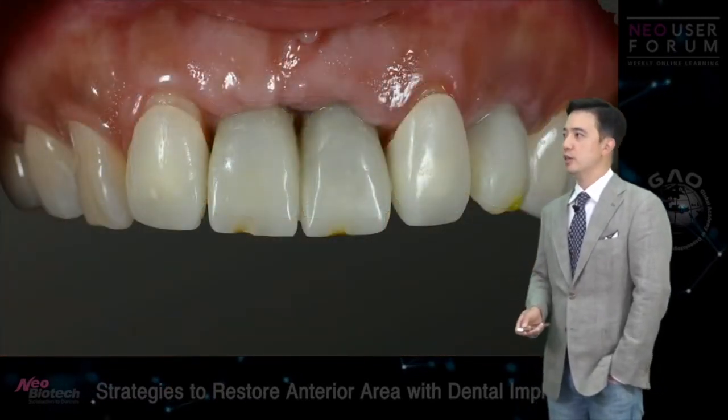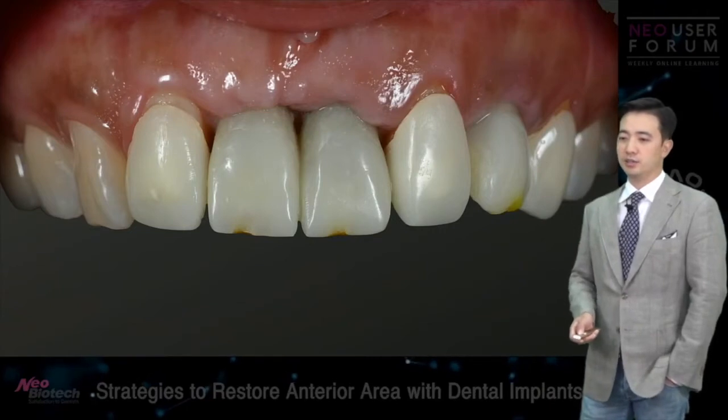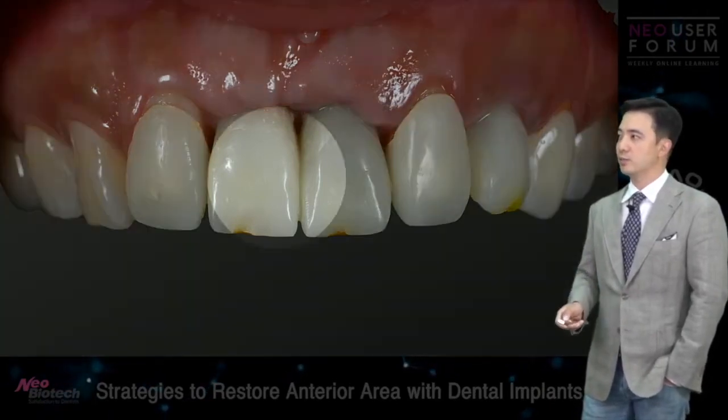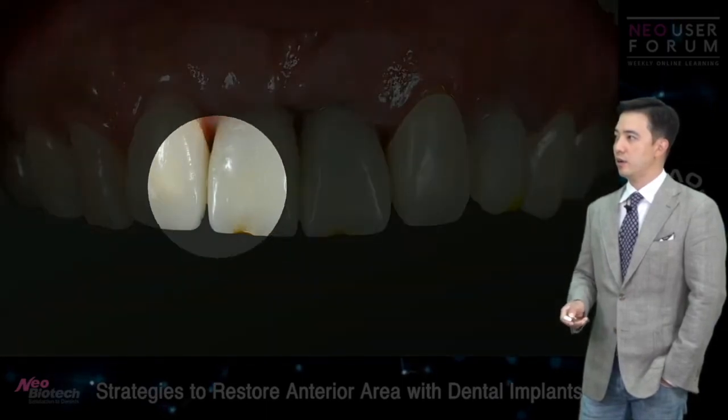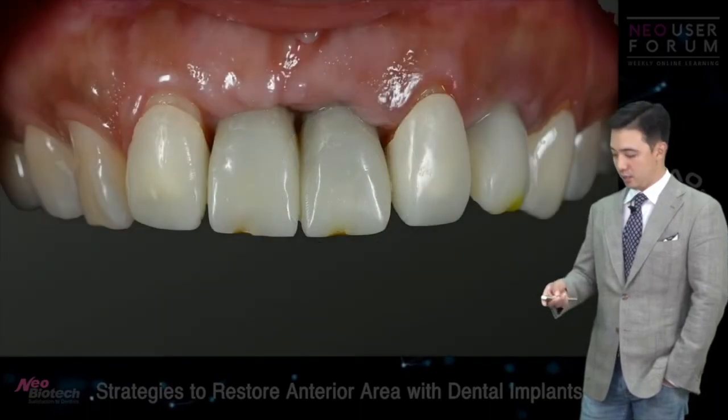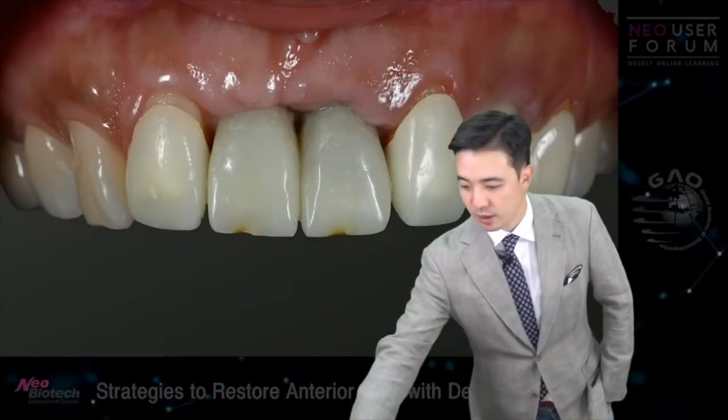when we tried to connect those provisional restorations on the implant, so this was initially part of a, so these two were pontics. Let's go back a little bit.